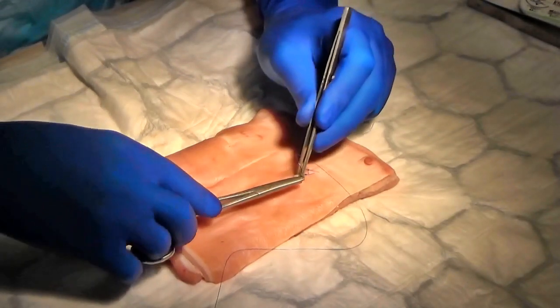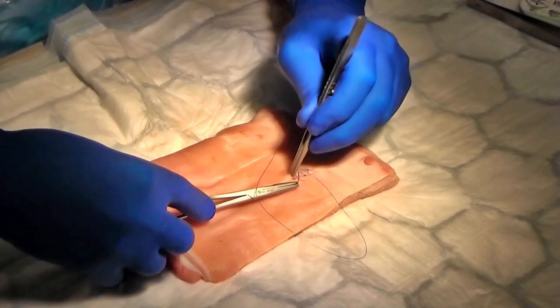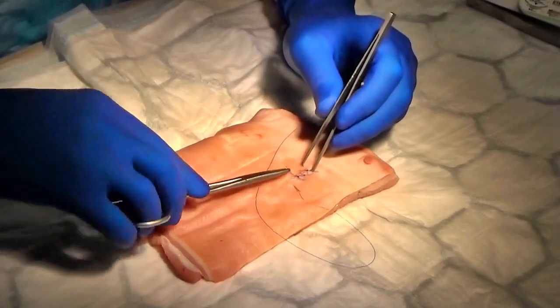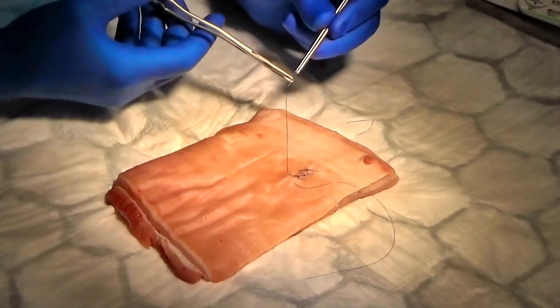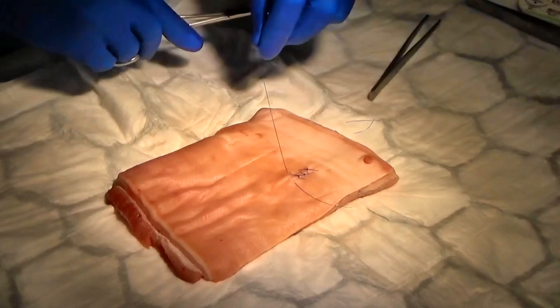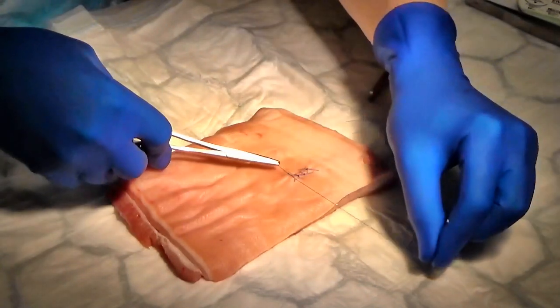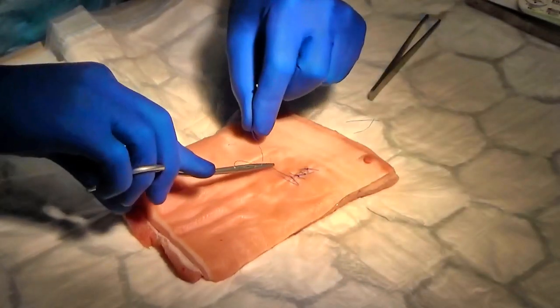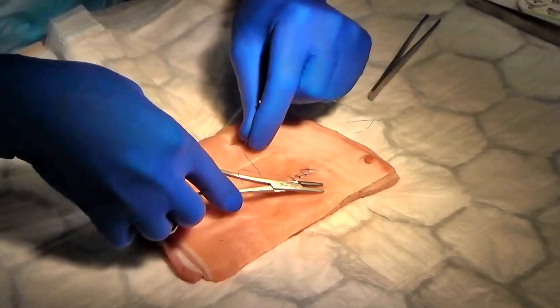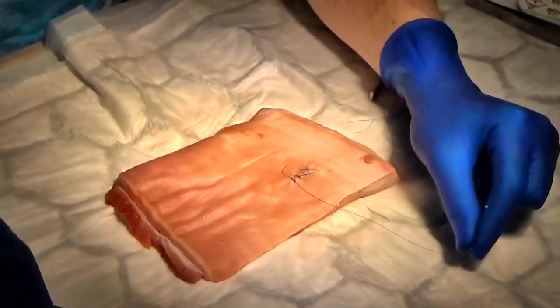Okay, and we'll just speed up. Notice on this one I'm cheating, I'm taking them just all in one together. Note the way that I keep crossing my hands.